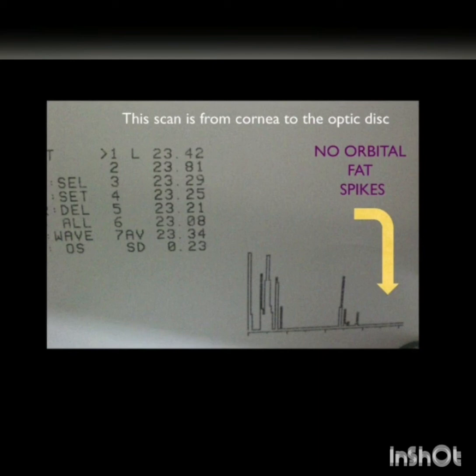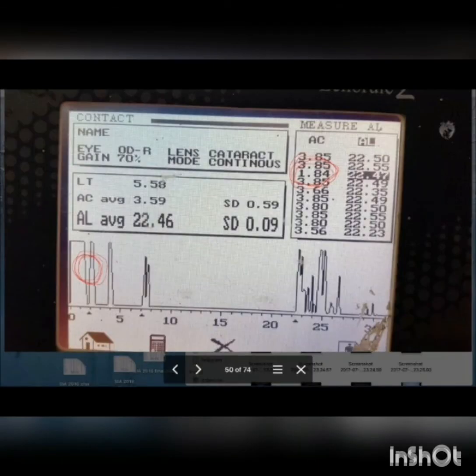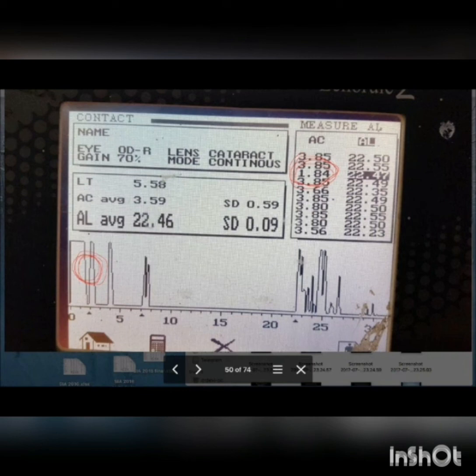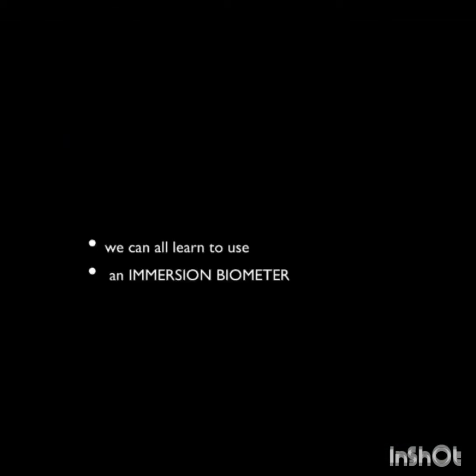If too much water, contact fluid, or paracaine is placed on the cornea, you can get a false anterior chamber depth — for example, a reading of 1.84 mm caused by a thick droplet of fluid acting as a coupling fluid between the probe and the cornea. This is measured as a false anterior chamber. Very shallow anterior chamber readings caused by excess fluid should be discarded.